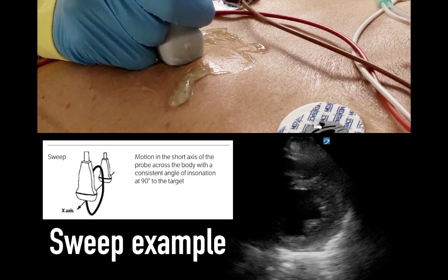This is effectively in the parasagittal plane for most patients. Just to review, sweeping and sliding are translational movements, but they are in orthogonal directions.